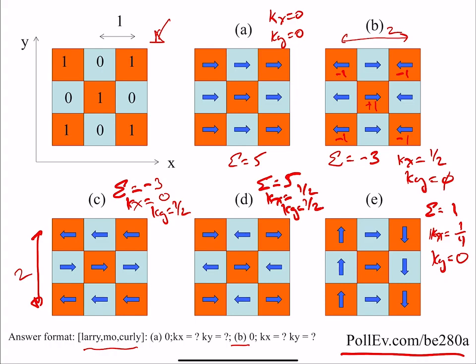And often people don't. But if you were going to go to a higher resolution, then they wouldn't be the same, because then you could distinguish which way it was going. All right. Okay, any questions? If you understand this problem, that will be good, because there will be other problems like this, and this is a very simple way of understanding what's going on with MR. So this is really the fundamentals of MR encoding.